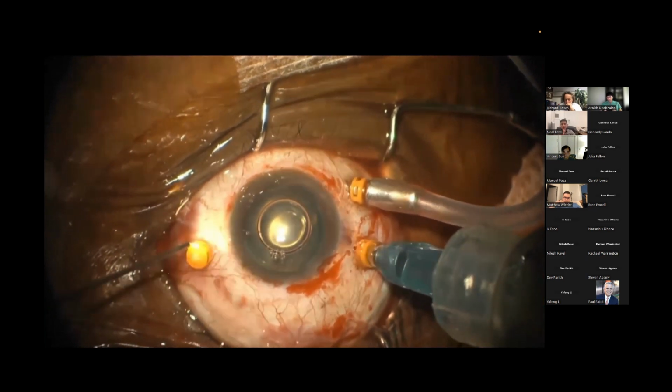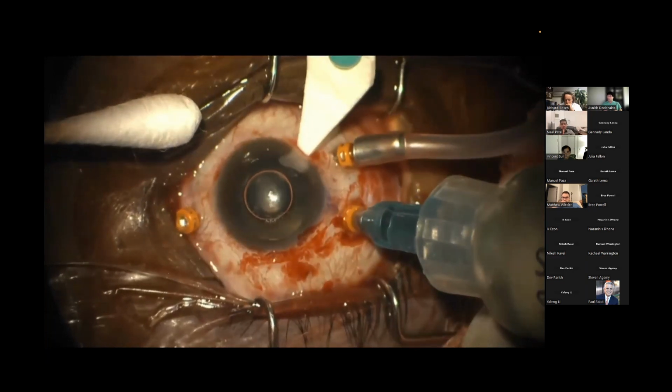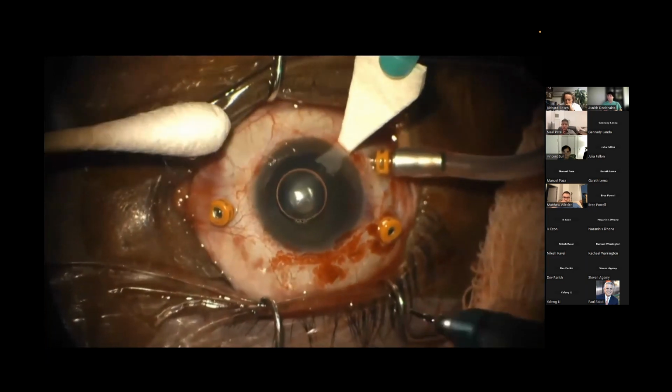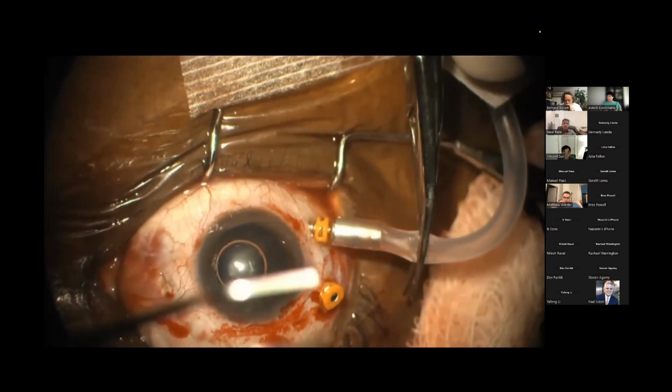And now we place our oil, and we see that the breaks are well lasered, and we top the eye off with oil. What kind of oil did you use, Neal? 5,000 centistoke silicone oil.